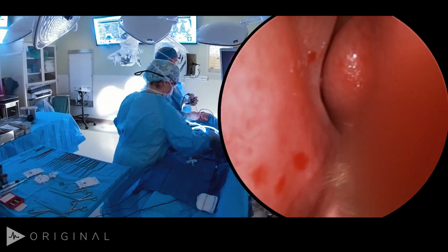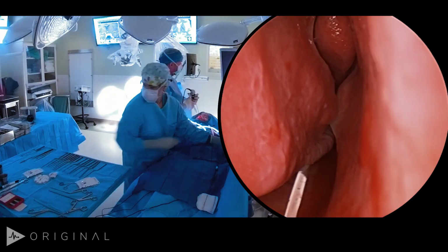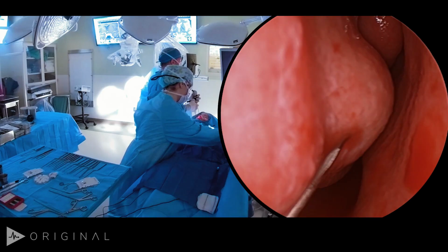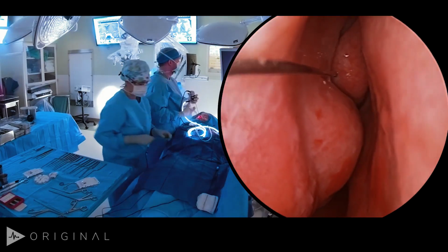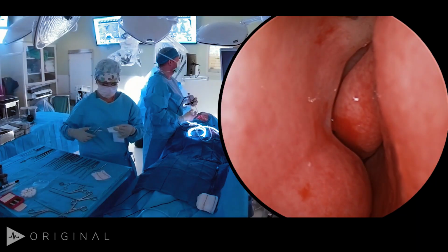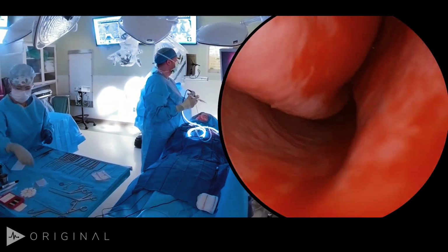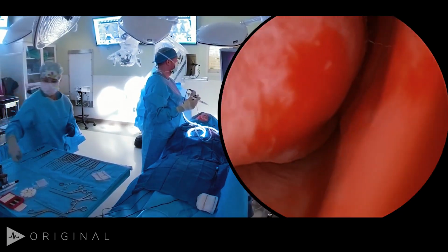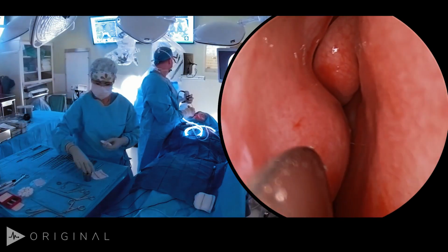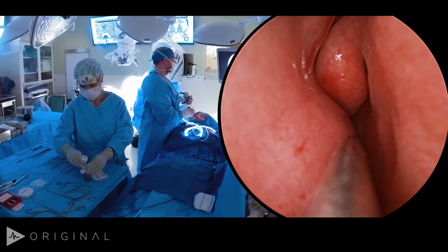Inferior turbinate, middle turbinate. I'm going to be injecting 1% lidocaine with epi 1 to 100,000. And we'll inject the inferior turbinate, and the middle turbinate, and try to get a little of the axilla, and then try to get a little bit back here along the septum. So I think that the thing that might make this slightly challenging is that she has a large septal spur there along the septum, and that might make it a little bit difficult, especially if we were going to raise a longer nasal septal flap. For the purposes of this case, I think we'll be okay because maybe we'll be able to just drop our flap right along it.